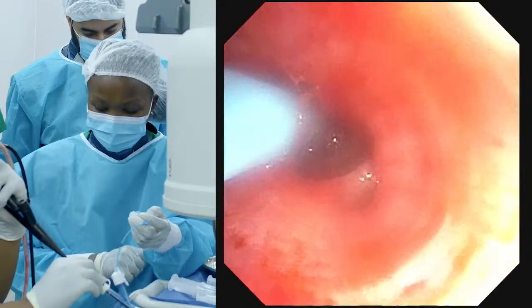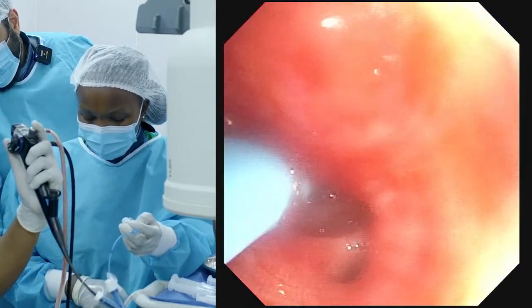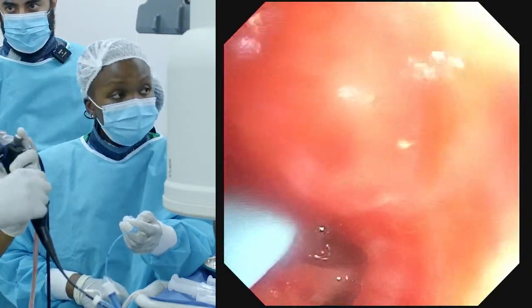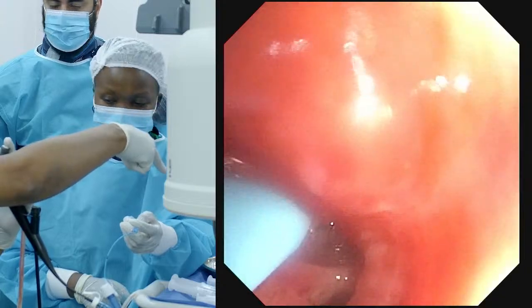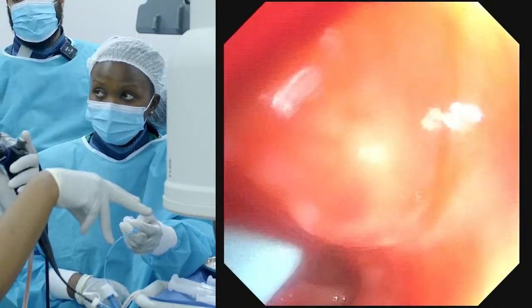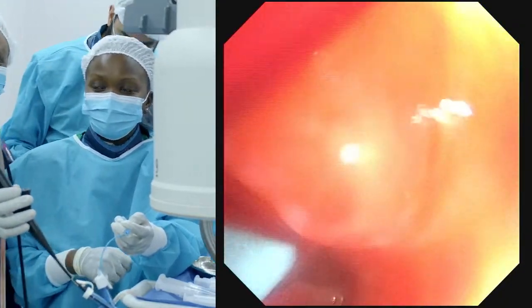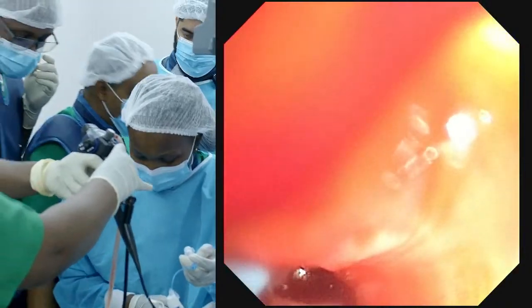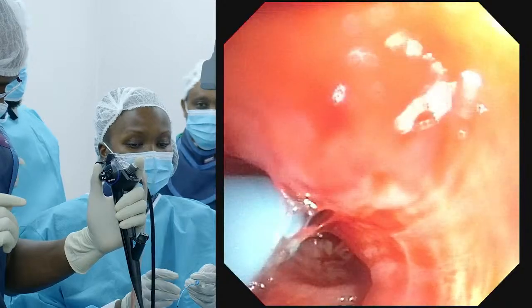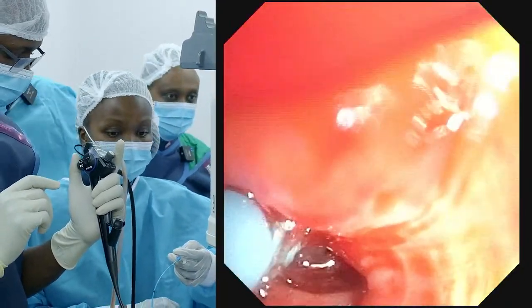Which pedal is for what? This is for fluoro, this one, and this for cryo. When you press to get the sample, don't release until the sample is out. Don't release the pedal because it will thaw and fall in. Let me just practice. So this is the cryo. Yeah, that's the cryo pedal.